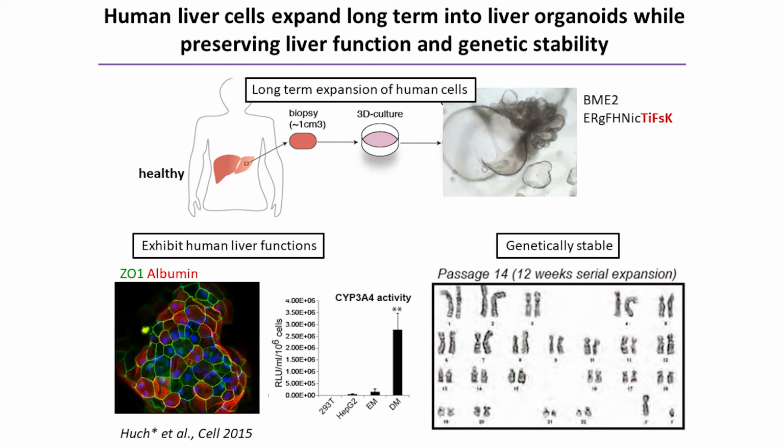For instance, cytochrome activity is one of the detoxifying enzymes that metabolizes drugs in the liver. We also showed that they can produce a bit of bile acid, but now Hans's hepatocyte organoids show that the differentiation capacity of the hepatocyte organoids is much better towards the hepatocyte fate. And going from this ductal fate to this hepatocyte-like fate requires a 15-day protocol of changing the media in order to make them differentiate.